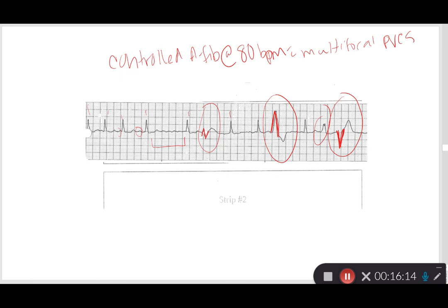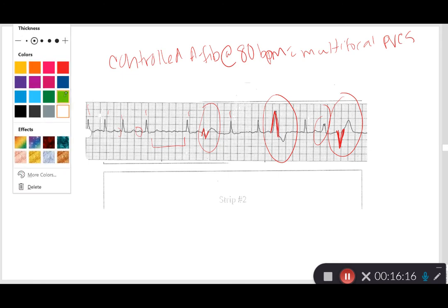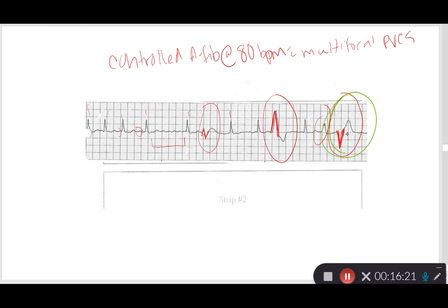One thing I did want to mention when I talked about, don't call it ST elevation. So looking at this, I'm just going to look at this complex here. I have a lot of students that try to label this ST elevation here. This is not ST elevation. This is not a normal ST segment. This is a ventricular beat. What you're seeing is that backwards deflection of energy going through the heart.